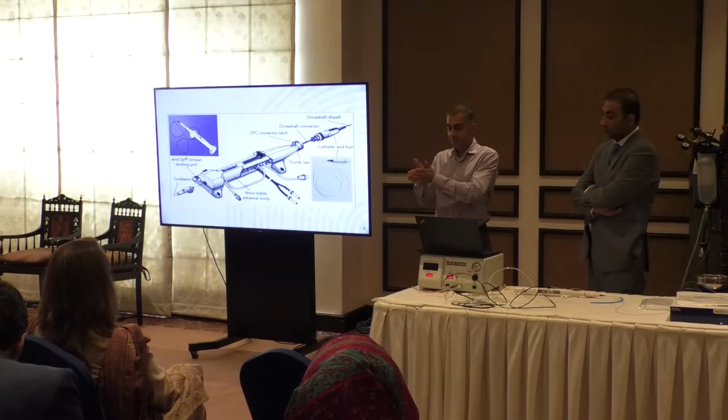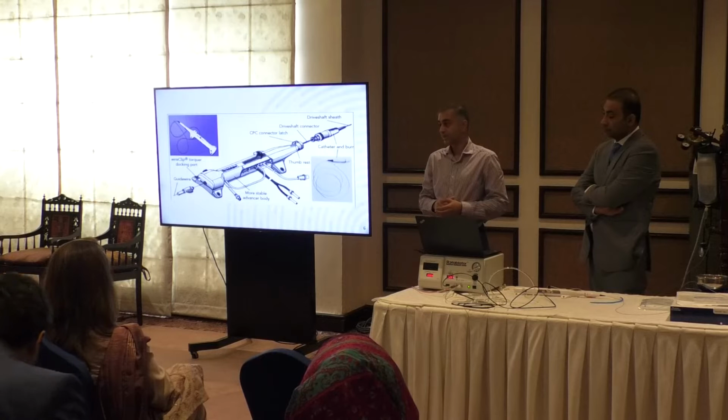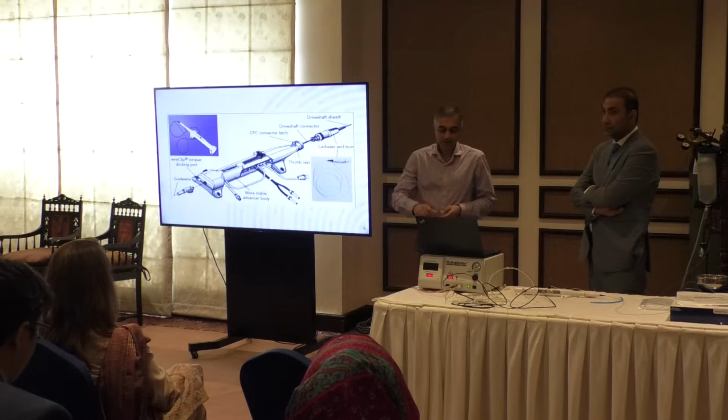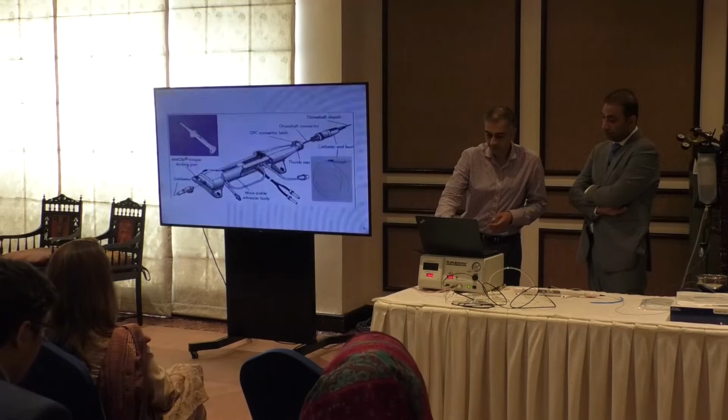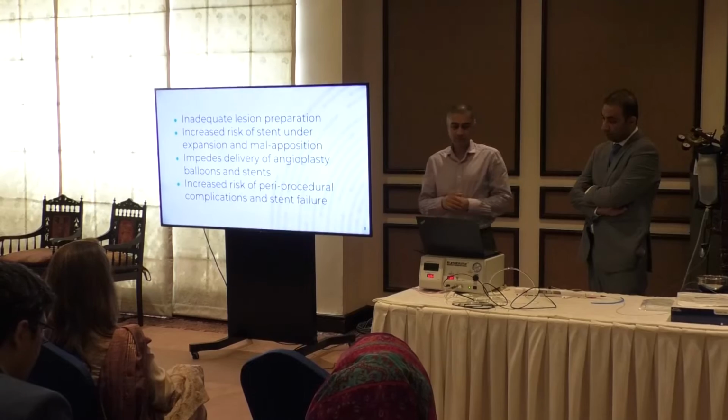Because there's no point putting a small burr in, it's not going to ablate the calcium, it's just going to fly through. You'll have wasted a burr. So that's the first thing you have to do. Apply common sense in terms of your burr selection.